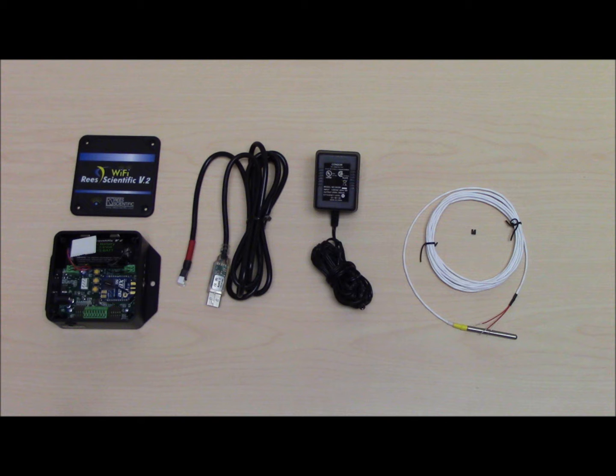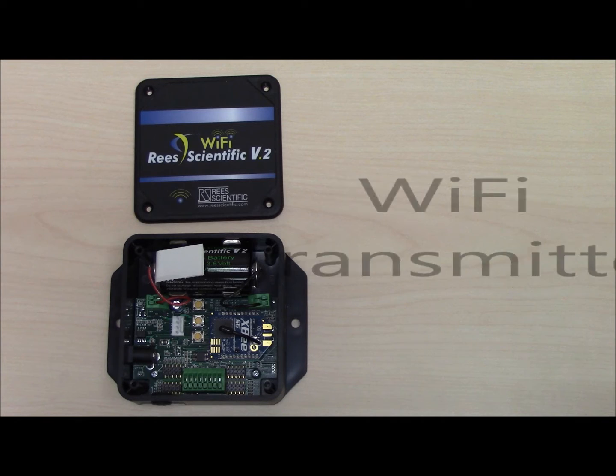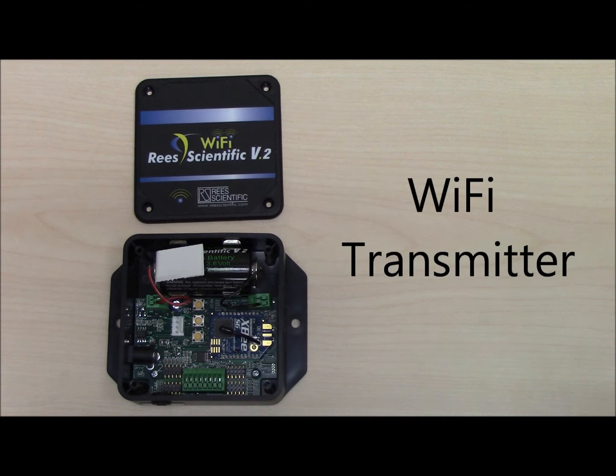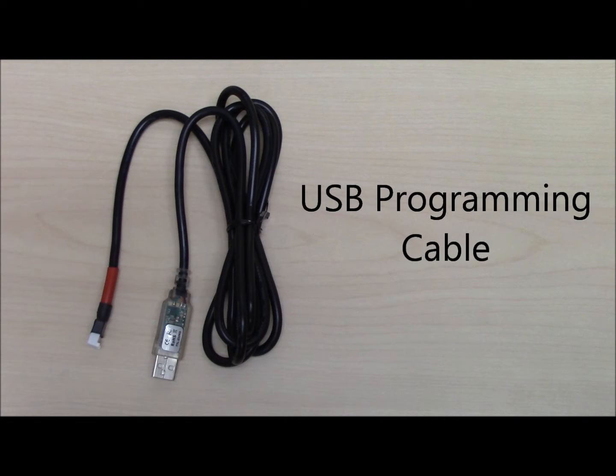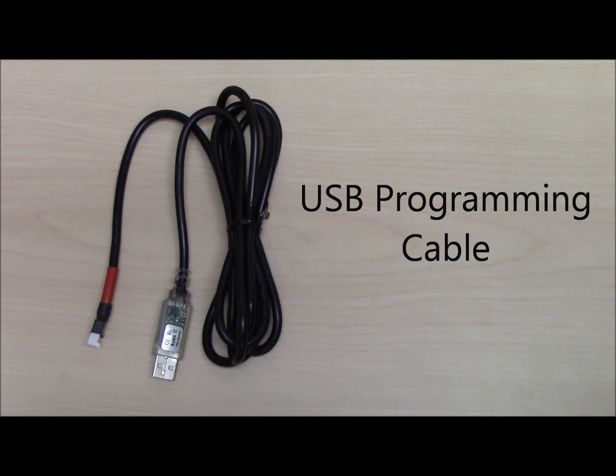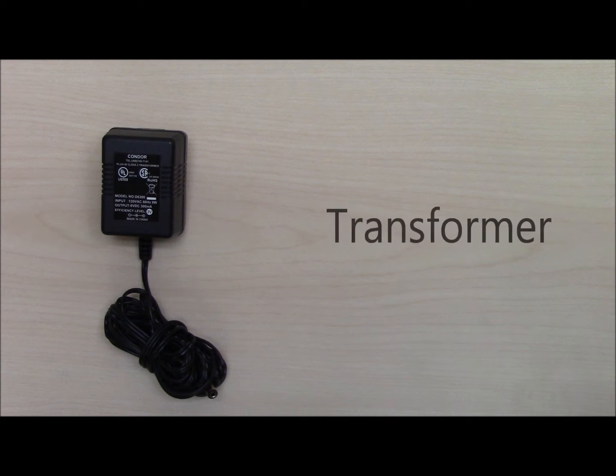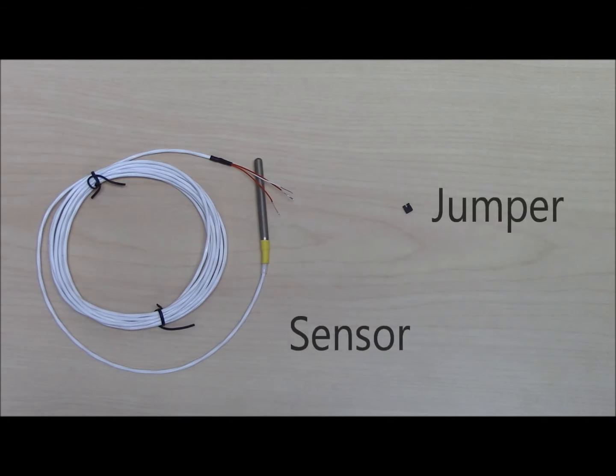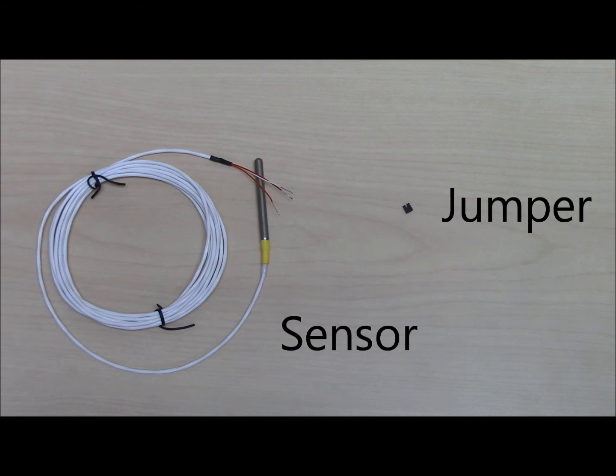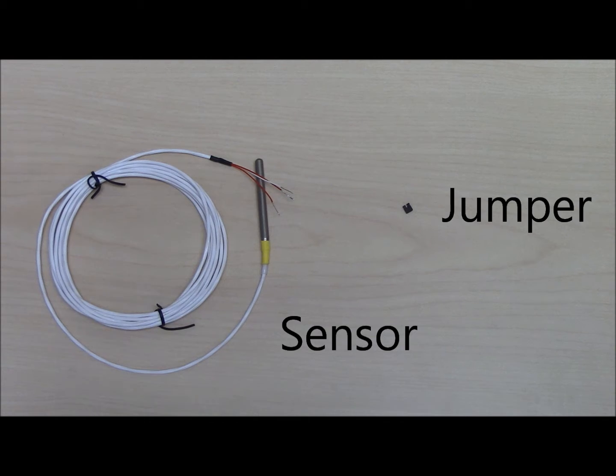The materials needed to set up a Wi-Fi V2 are a Wi-Fi transmitter, a USB programming cable, a transformer, a sensor for each input, and a jumper for each input.